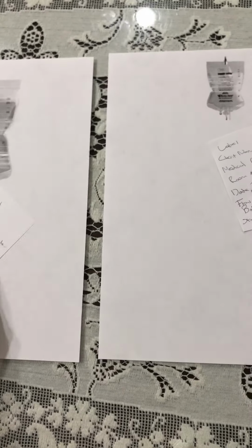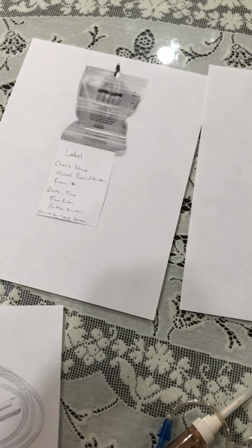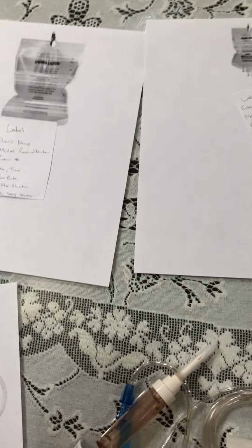And before I leave the room, I want to grab all my equipment, my special tubing, and I want to grab these papers right here, which are labels for my solutions. These labels have the patient's name on it, the room number, the date and time, the flow rate that's prescribed to them, the bottle numbers, the medical record numbers, and the start and stop times of the solutions.